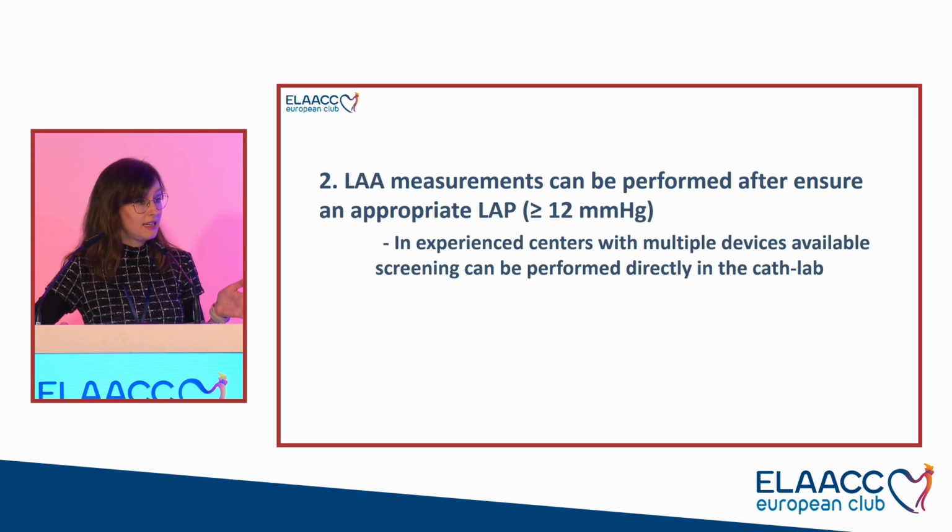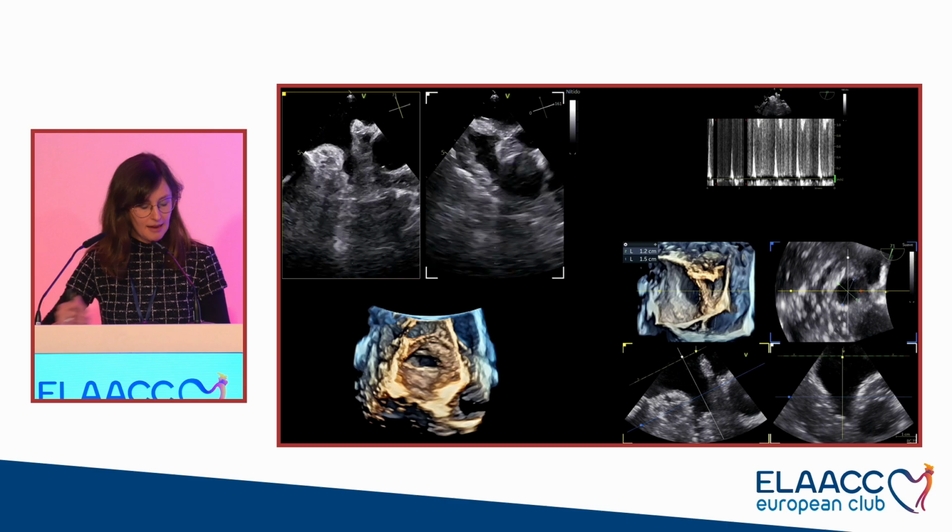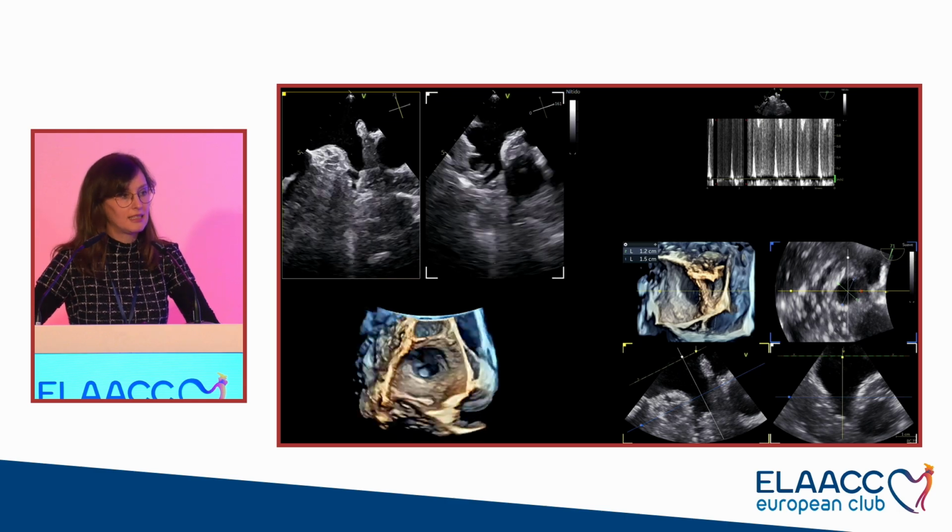And the patient, again, is awake, and at the end, it's more or less the same sedation that we use in the echo lab, so it's not a big deal if then you see a protruding thrombus or something. So this is an example just to illustrate this kind of difficult case.